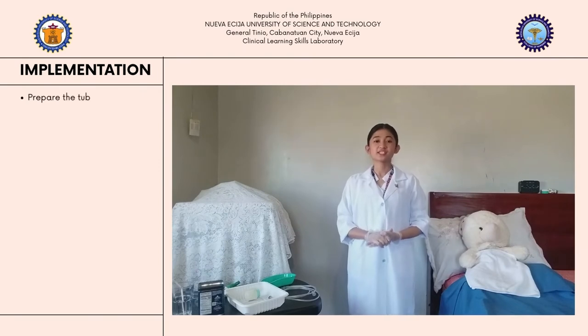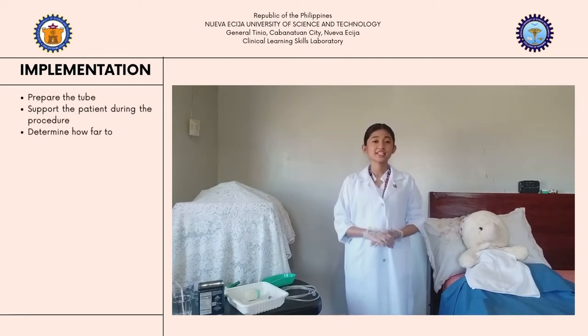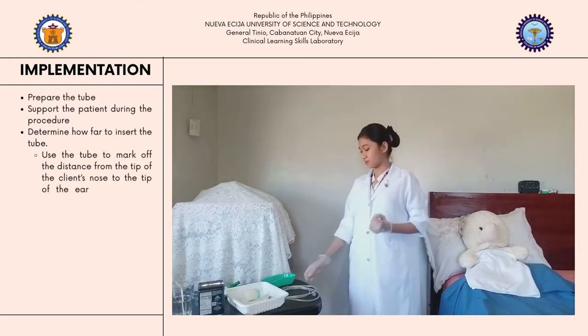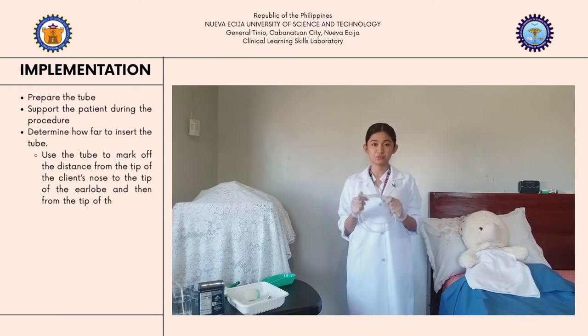After assessing the nares, we need to prepare the tube. The preparation will vary depending on the size of the tubing that we will be using. For a small bore tube, we need to ensure that the stylet or the guide wire is secured in position to prevent any injuries to the mucosa during the insertion. But for a large bore tube, prior to the insertion, we need to place it in a basin of warm water to make the tubing more pliable. And for this demonstration, I will be using a small bore tubing.